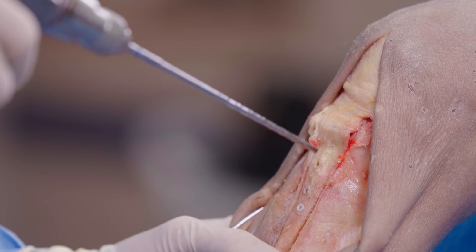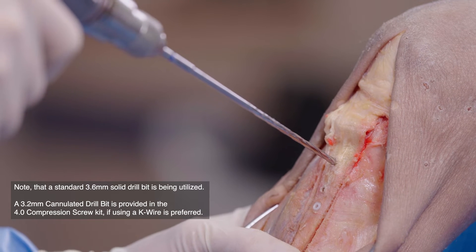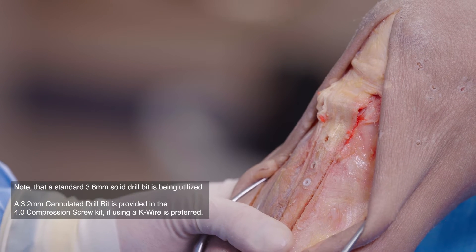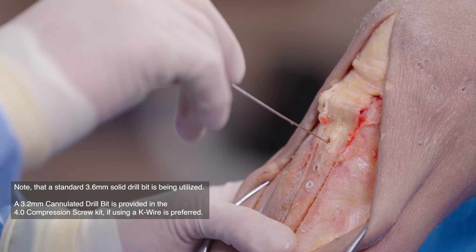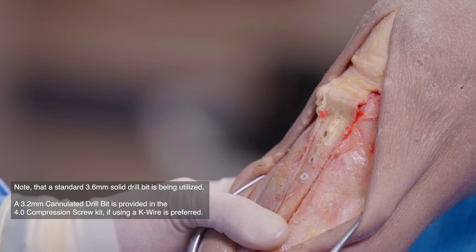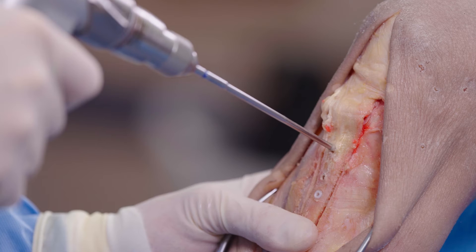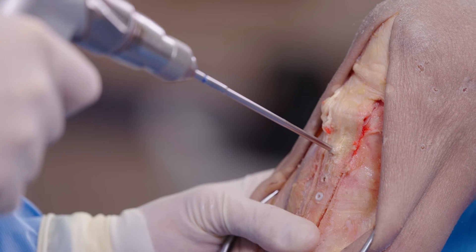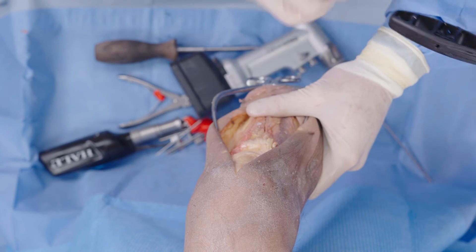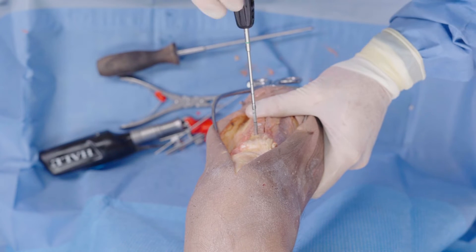Under fluoroscopy, I would be doing this in the lateral view. In this instance, I'm using a 3.6-millimeter drill. Alternatively, I could put in my K wire and drill that bicortically. You want to be very careful that you're not going too posterior — we don't want to plunge into the neurovascular structures. Once I feel the posterior cortex is through, I'm going to use my tap again, which has measurement marks so we can measure off the tap itself.